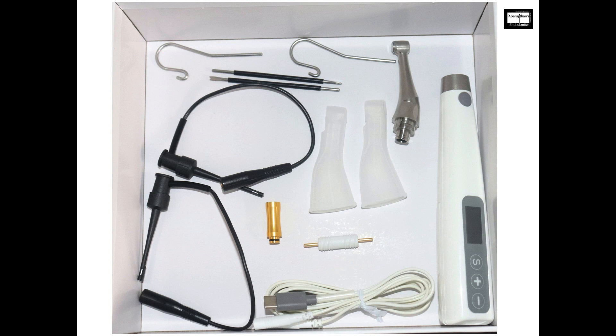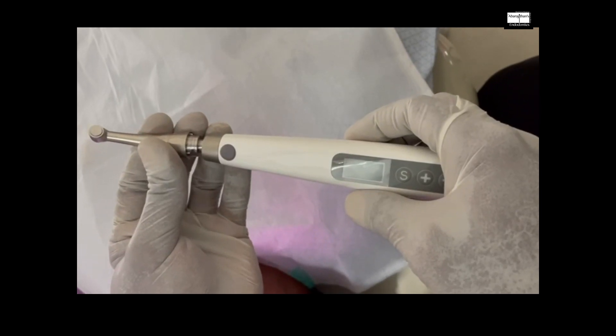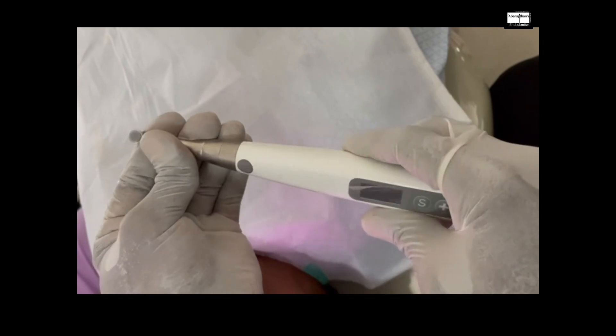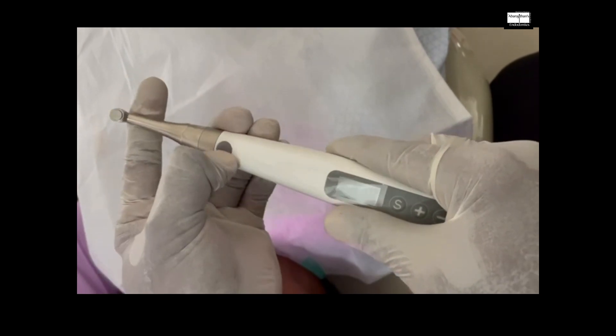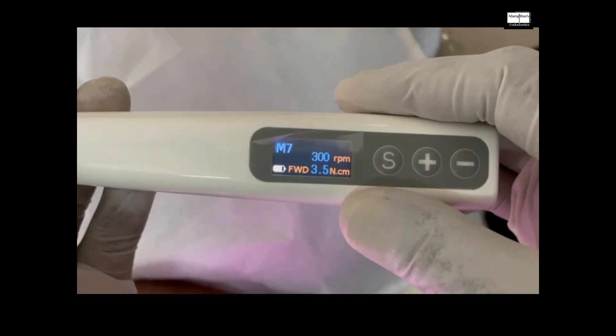The package includes a C-type charger, the handpiece, the head, and some other accessories like oiling devices. We start by fixing the head of the endomotor to the handpiece. This is a 360-degree rotatable head. To turn the endomotor on, you press the power button.